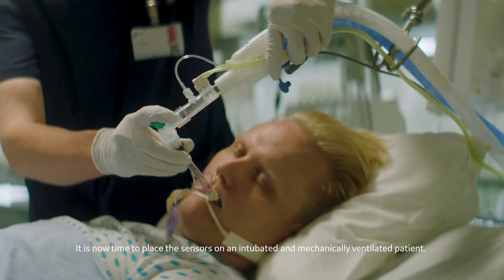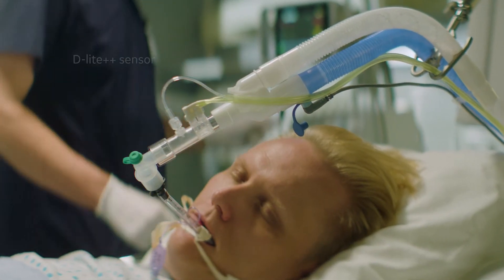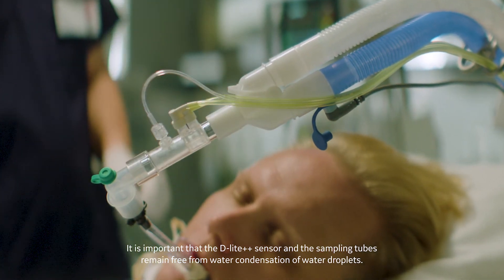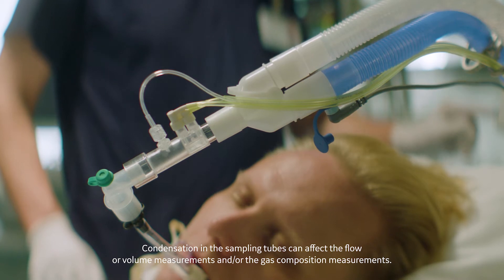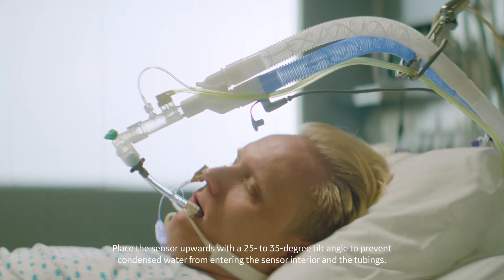It is now time to place the sensors on an intubated and mechanically ventilated patient. It is important that the D-Lite++ sensor and the sampling tubes remain free from water condensation or water droplets. Condensation in the sampling tubes can affect the flow volume measurements and/or the gas composition measurements.